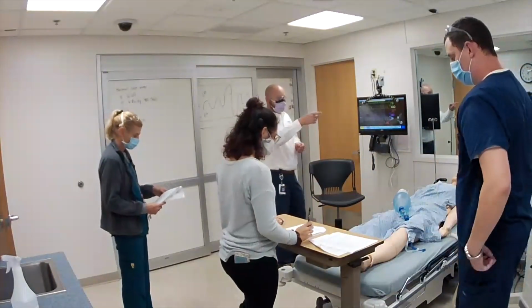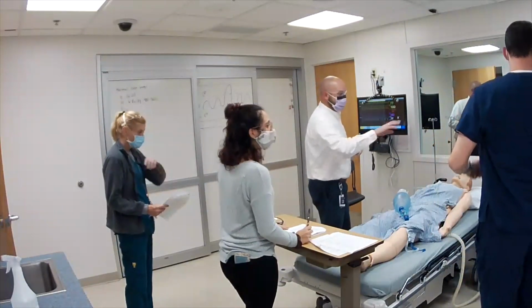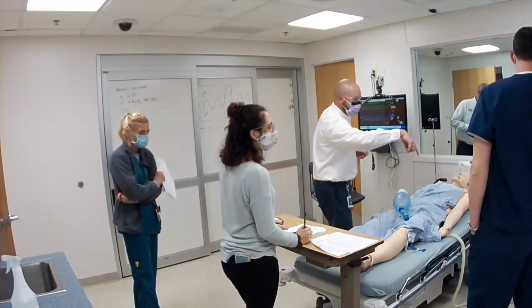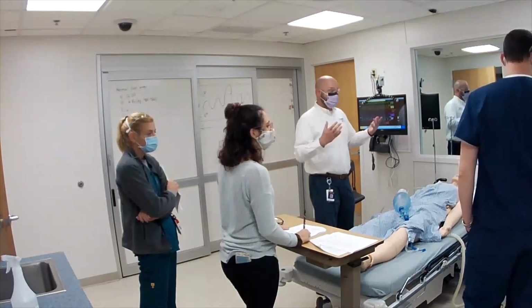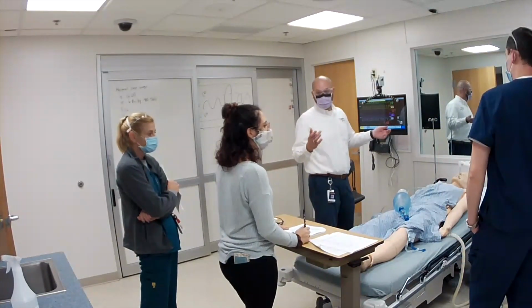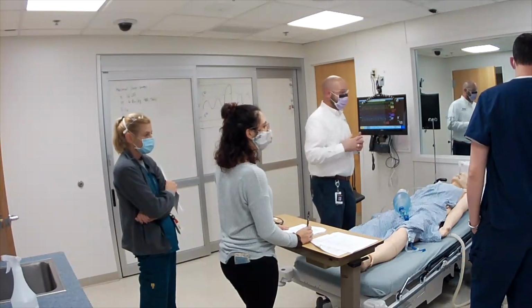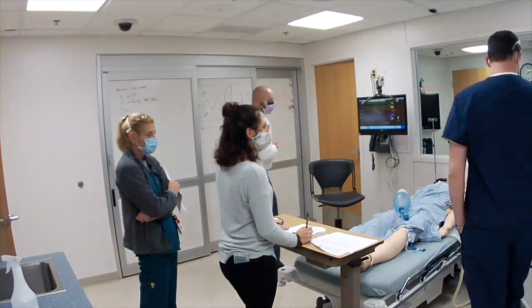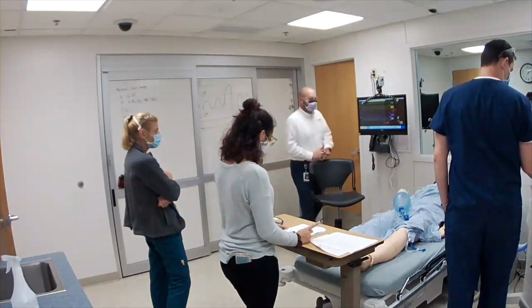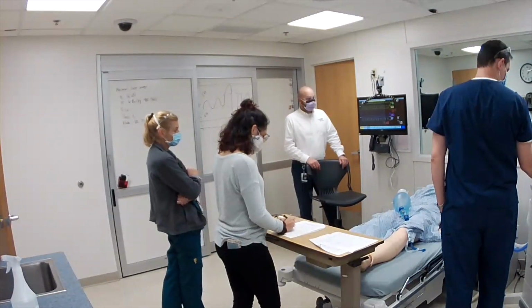Now, will you do an expiratory hold for me? Thank you, sir. And do the other one. Do inspiratory? Yep, inspiratory hold as well. And we'll generate some values here. Did we get them? There we go.